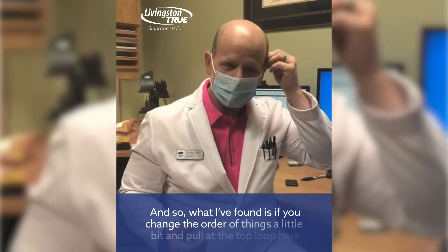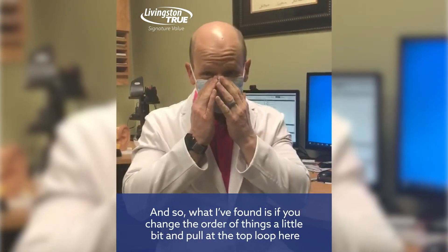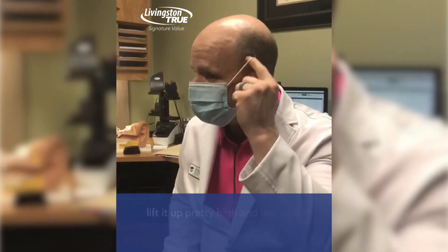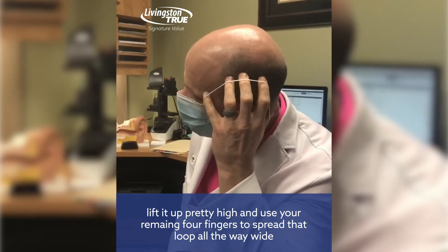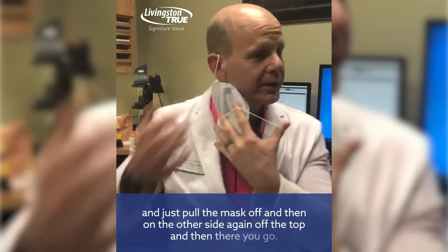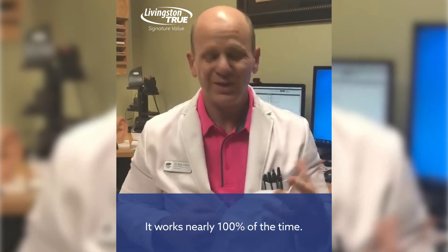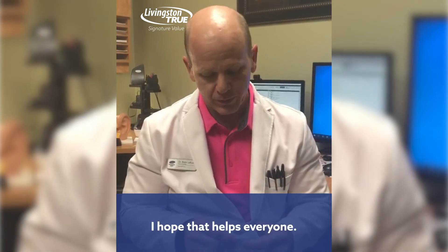What I've found is if you change the order of things a little bit and pull with the top loop here, lift it up pretty high, and then use the remaining four fingers to spread that loop all the way wide and just pull the mask off — and then on the other side, again off the top — and there you go. It works nearly a hundred percent of the time. So give that a try and share it with your patients, and I hope that helps everyone.